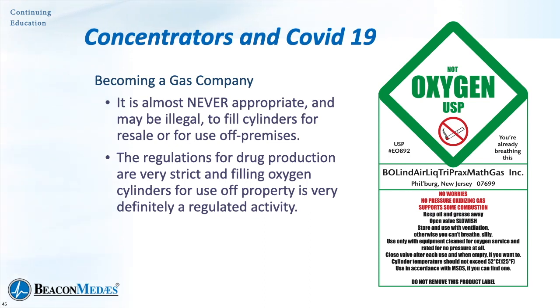If you did, there are a bunch of considerations about labeling, making sure you control the cylinders, that the cylinders that come from outside and the cylinders that you use within your hospital are kept separated. We want to make sure that our cylinders don't get out into the great wide world and that we don't fill cylinders that don't belong to us. Difficult thing to do. If we're going to fill cylinders on site, it should be for a fixed purpose, not for moving those cylinders around the building. And we could never take those cylinders and sell them to someone else.